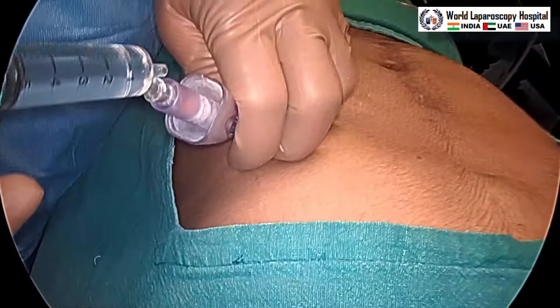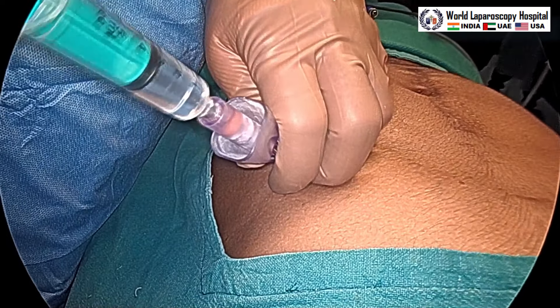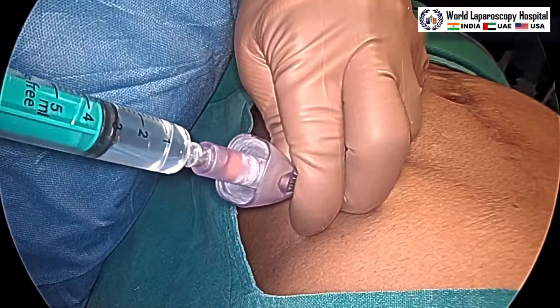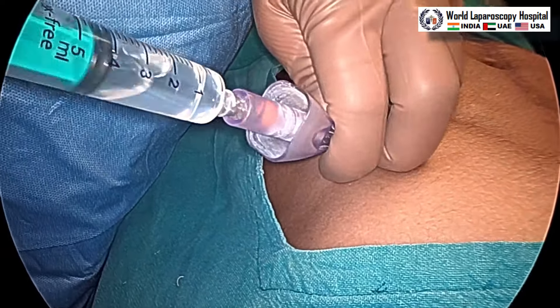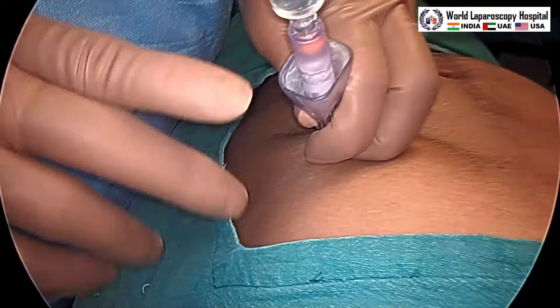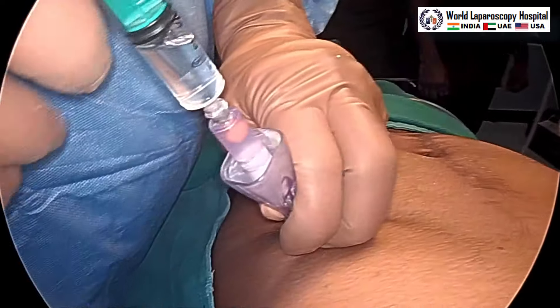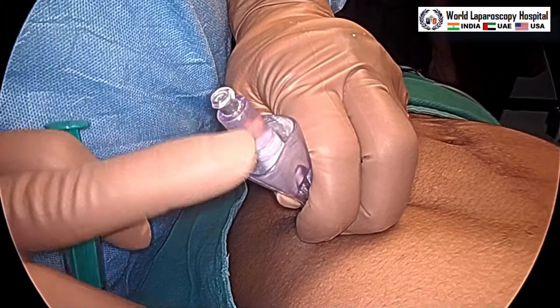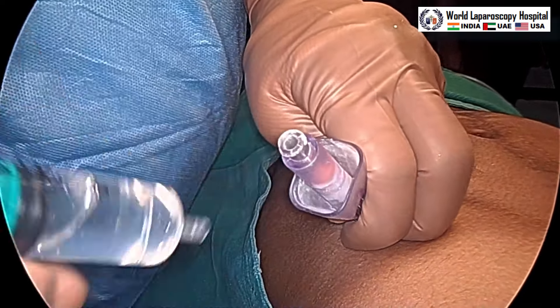The stomach must have a nasogastric tube in place. Here we can see irrigation followed by suction and then the hanging drop test. You can see there is a ball in the disposable Veress needle. Once you remove the syringe, this ball itself will shrink — that is one type of hanging drop test.